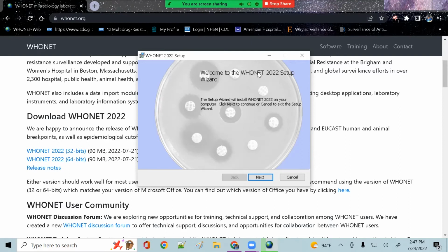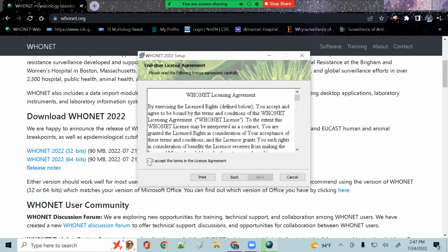Welcome to the WHONET 2022 Setup Wizard. The Setup Wizard will install WHONET 2022 on your computer. Click Next to continue or cancel to exit the Setup Wizard. Here we'll click Next. Okay, I'm going to accept the licensing agreement.